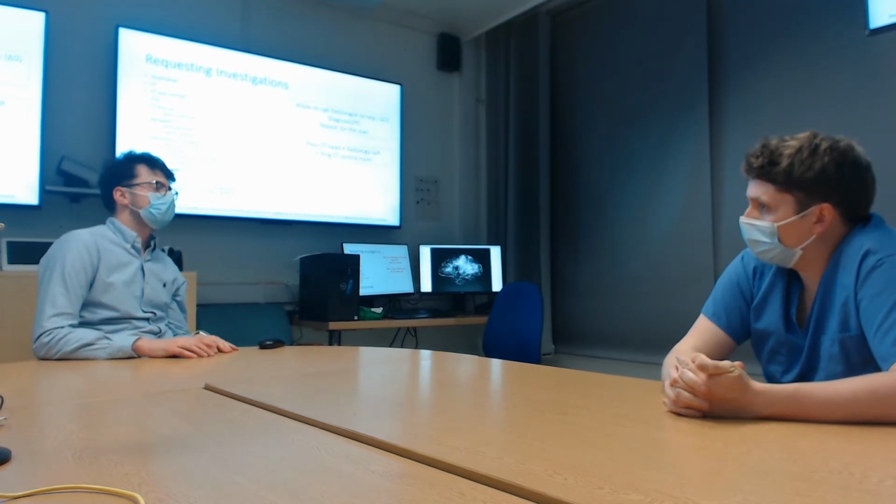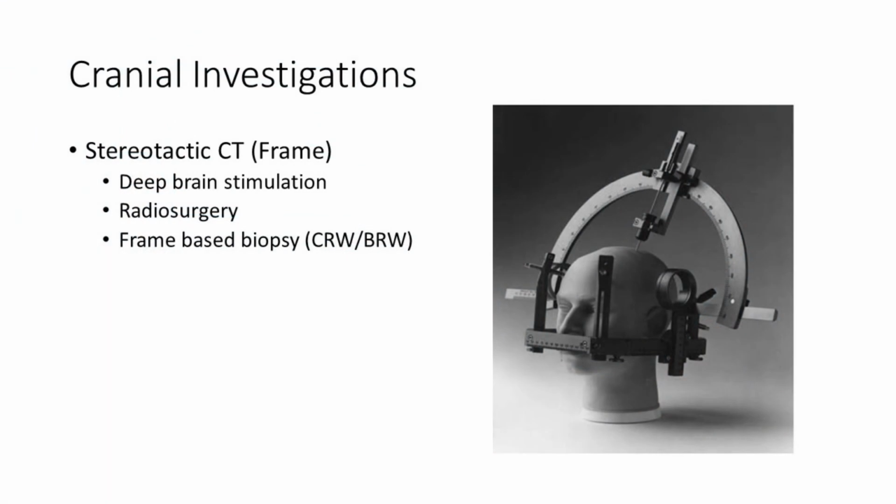Okay. And something that I've never ordered is a stereotactic CT. So again, the angle of the gantry of the scan is slightly different. They'll probably do a slightly different cut, and also they'll have the frame placed on them before, often whilst they're asleep in theatre. They'll be wheeled in on a trolley with the frame, and then that frame will get attached onto the scanner bed, and the whole scan will be done in reference to that frame. So they're slightly different.